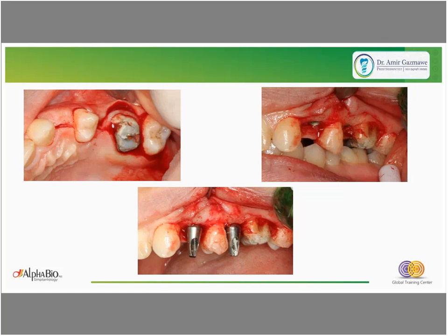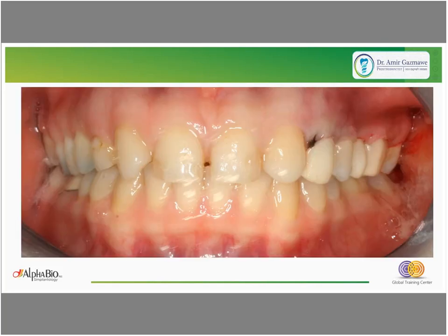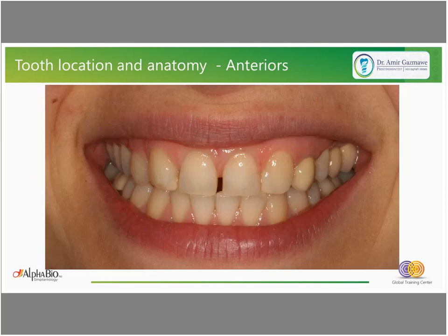So we connect the abutment to the implants according to the angulation. We make adjustment of the height, and finally make the temporary restoration. And we can see that we have a restoration that converts the laterals into canine, and we have the missing teeth restored by implant-supported prosthetics. So the abutment selection in this case can also make a difference with the interdental, influenced by the interdental space and the restoration intermaxillary height.